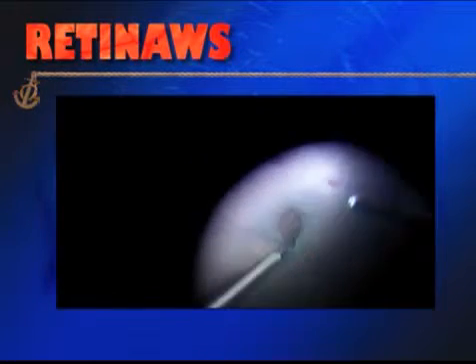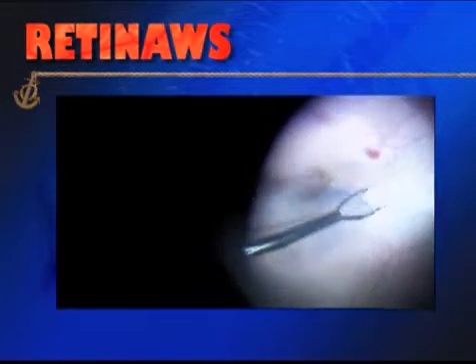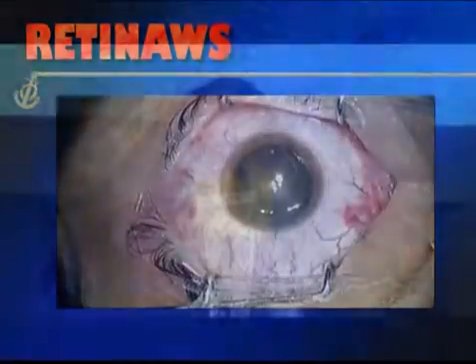This was a quite large macular hole, so I followed the technique of Dr. Nawrocki from Poland, who leaves the ILM around the edge of the macular hole. He leaves it behind in order to work as a scaffold to the retina, to the new retina, to go and close the hole. And that is how the eye looks at the end of the operation. I think it's a very nice instrumentation for macular hole surgery.